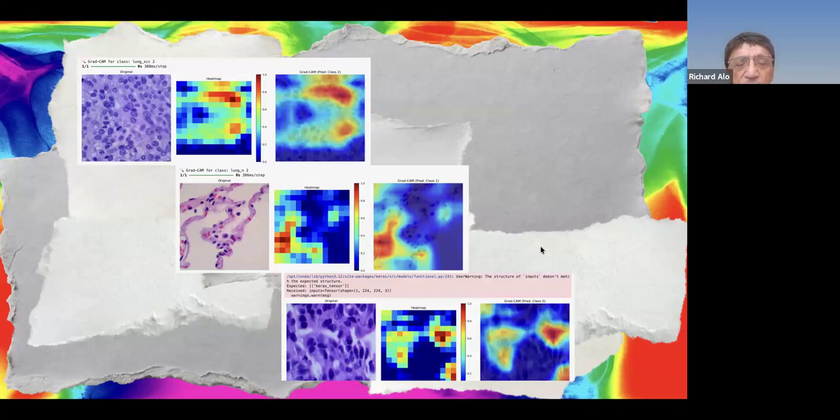But the other question I have is, the model that you've used here, you're using it for lung cancer. Is this transferable to some other cancers? Could you use it on some other cancers? I think it should be possible as it's really just an image of the tissues.